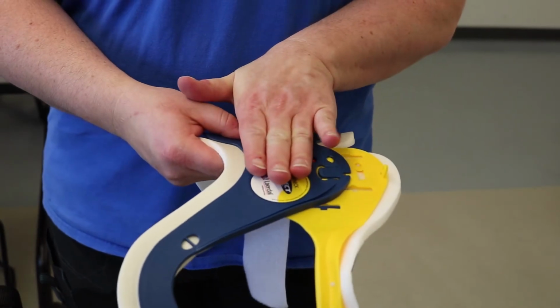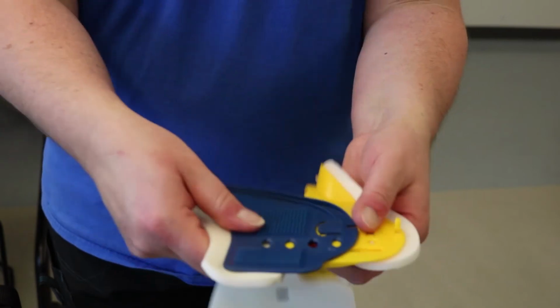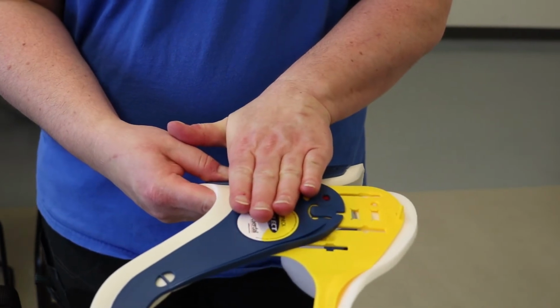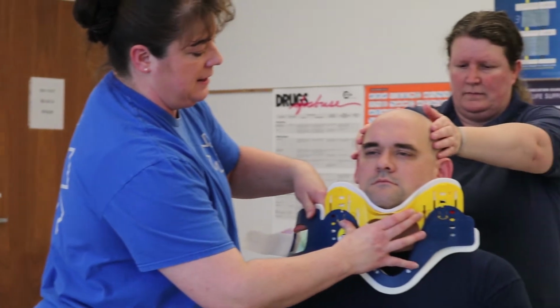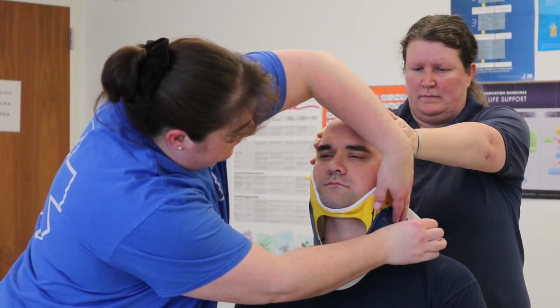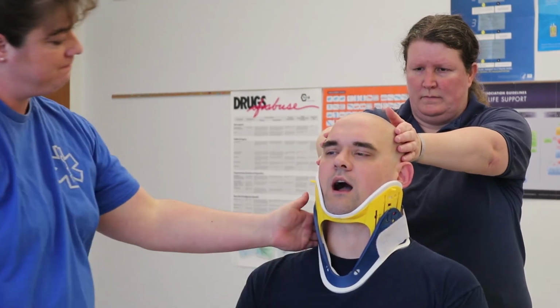Apply that measurement to the collar, and then I will adjust. And then I'll place it. And then position on the patient. Can you open your mouth? Okay. We'll now position the patient to place the device.